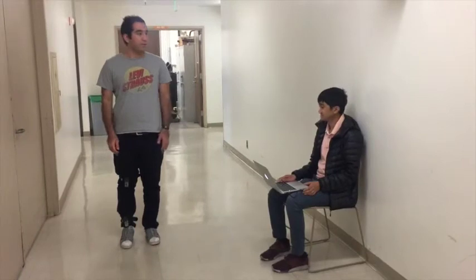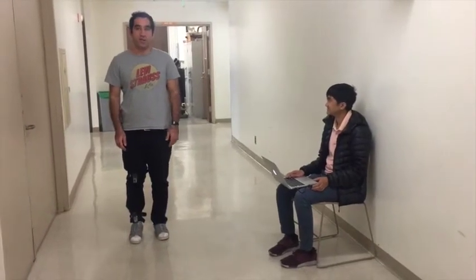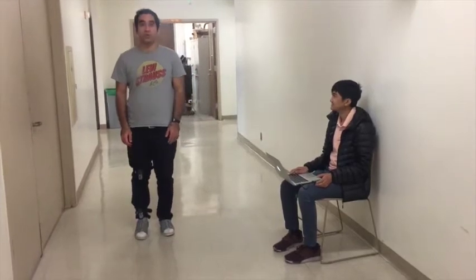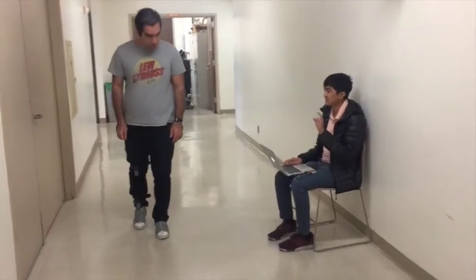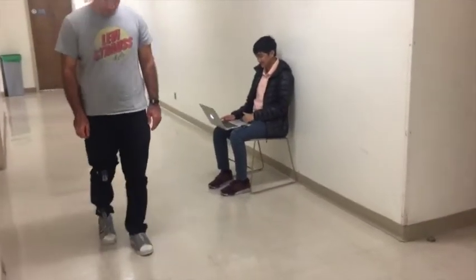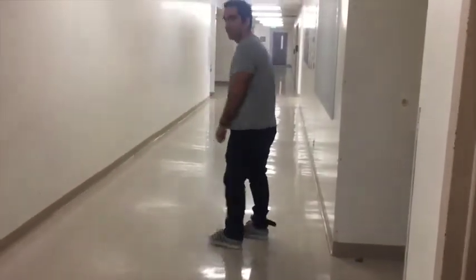Okay, we have Patrick on the laptop doing the data acquisition, and I'll have the sensor tiles on doing the walking. So we're doing the short strides. Set, go. Okay, stop. That's 10 seconds.